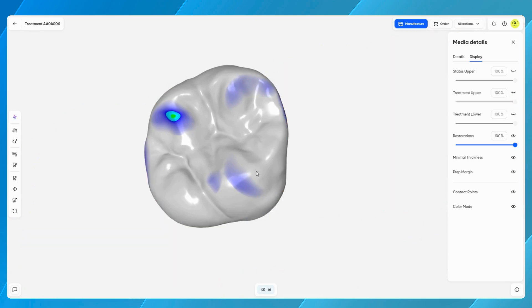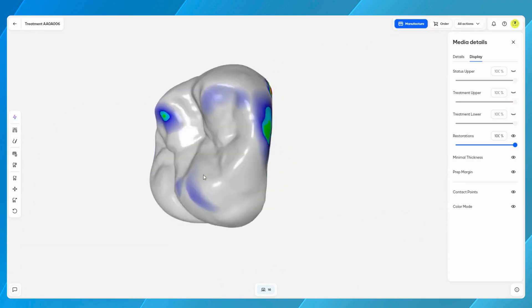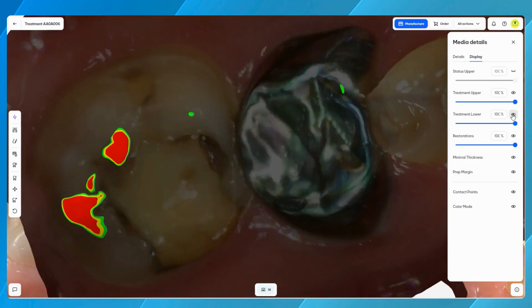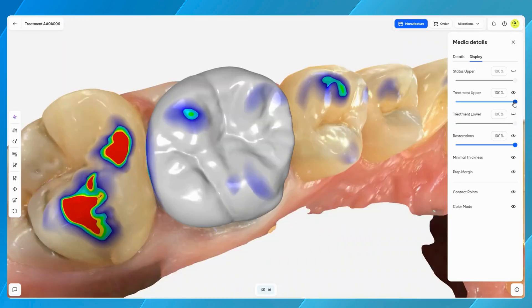Occlusal contact points can be turned on and off, same as the scan color, prep margin, and minimal material thickness.